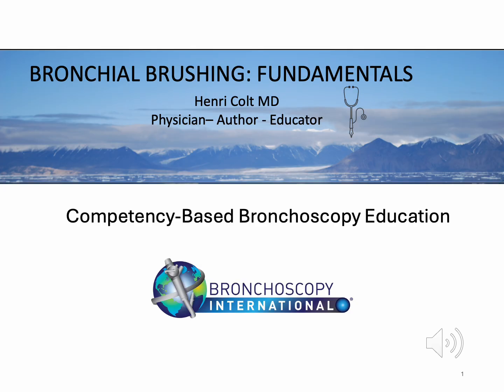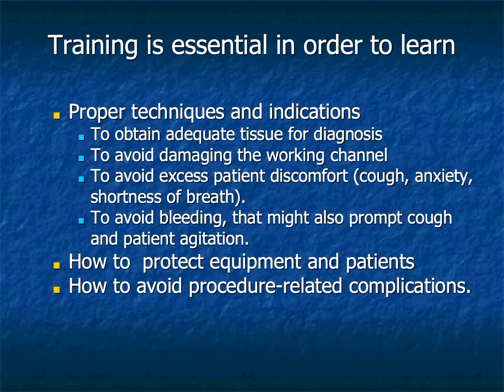Training is essential because bronchial brushing appears deceptively simple. A brush is advanced, cells are collected, samples are processed. Yet beneath these mechanical actions lies a complex interaction among anatomy, pathology, judgment, patient comfort, specimen adequacy, and procedural risk.